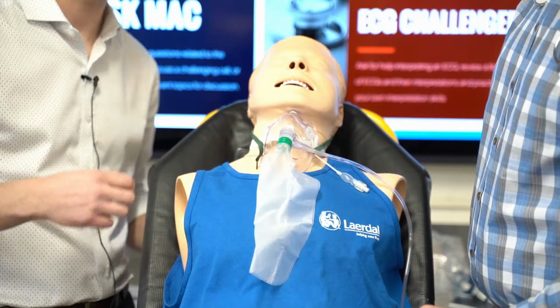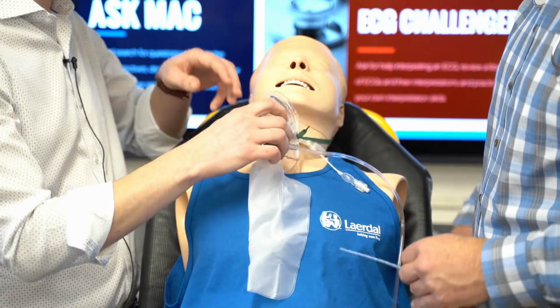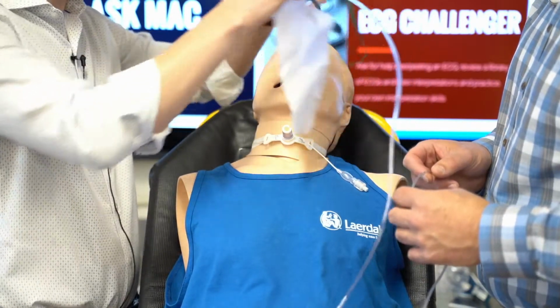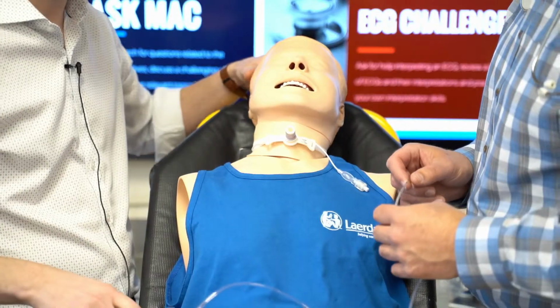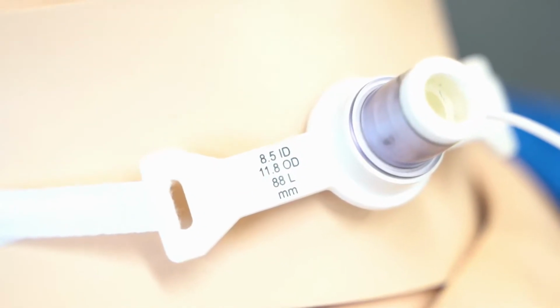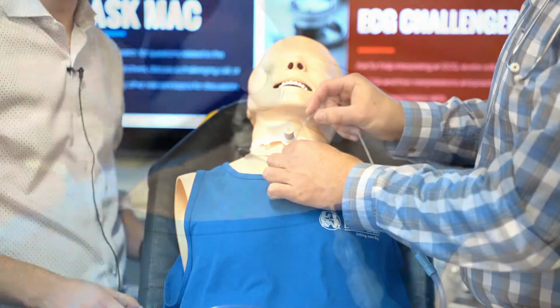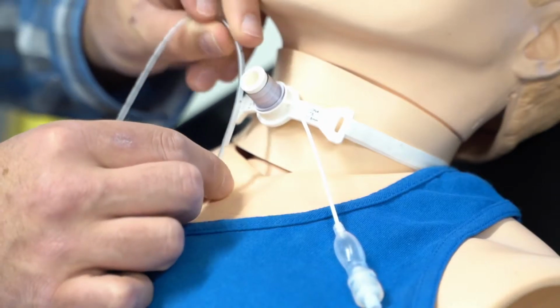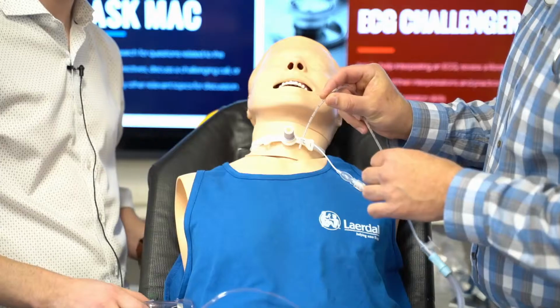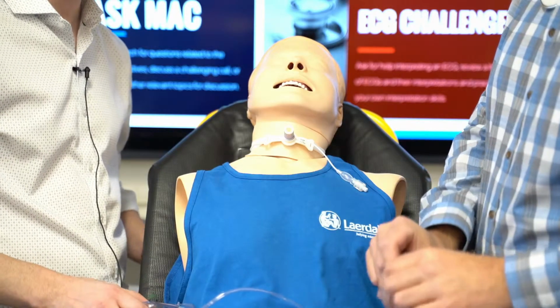So I'm going to take off my oxygen mask, and Pete has already pre-sized. How we do that is we take the inner diameter of our tracheostomy tube and multiply it by 2. So 8 is our inner diameter, times 2, we have 16. This is going to be our max French catheter that we're going to use. Pete's sizing this up, going in between the two clavicular heads, and that's going to be our maximum depth. He's going to pre-lubricate with some sterile water.